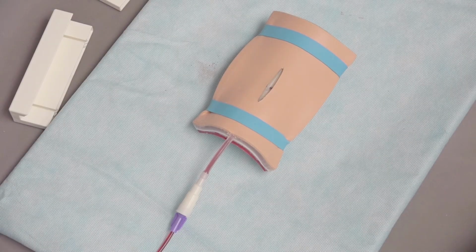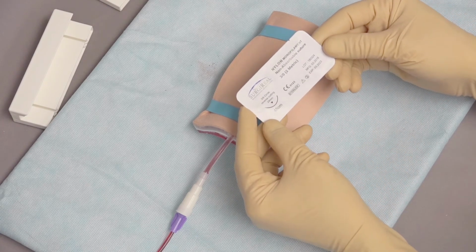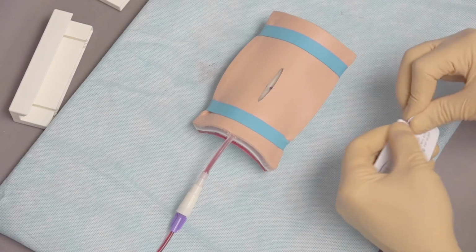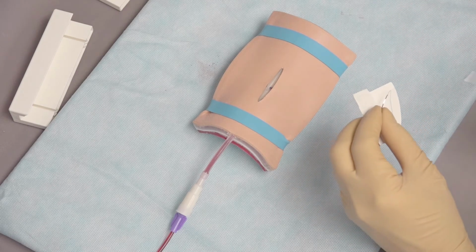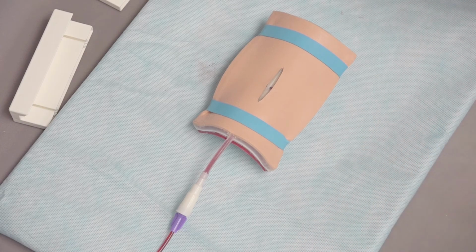So now that we've provided adequate hemostasis, we're going to go in and close. We're going to use a 3-0 nylon material to close the skin in this case. So not only are these pads useful for learning how to ligate vessels, but they're also valuable to learn how to close the tissue layers. So you can go all the way down to the muscle and external fascia.